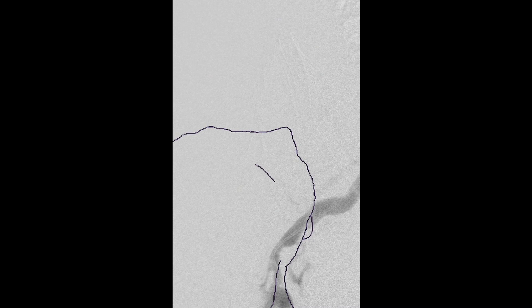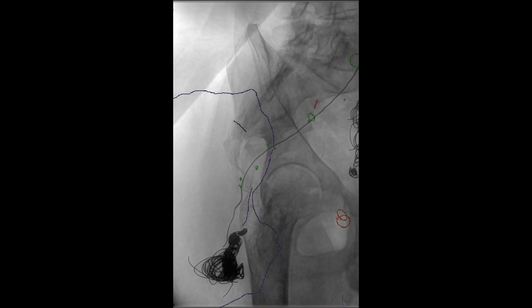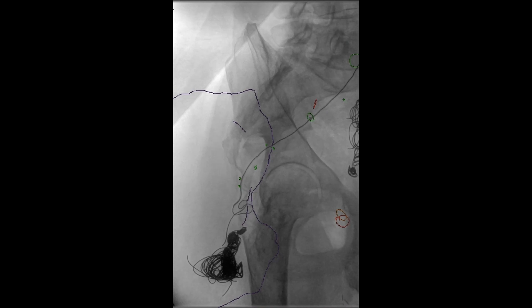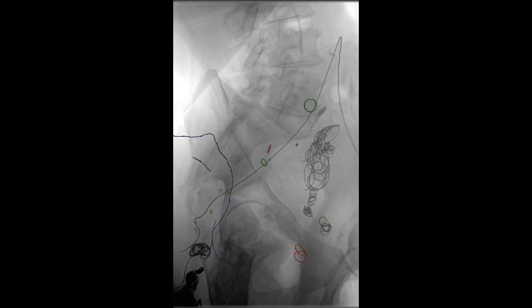This patient had previously had a history of embolization. Clearly this had failed and he now had reperfusion and bleeding into his buttock. So we selected these branches — superior gluteal branches — which were identified off the preoperative CT scan.